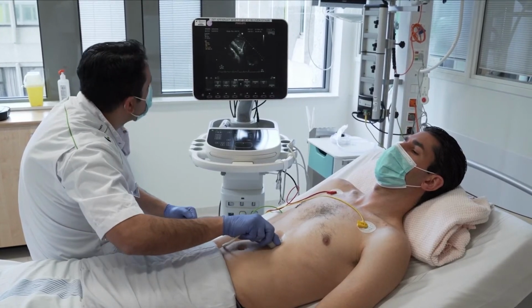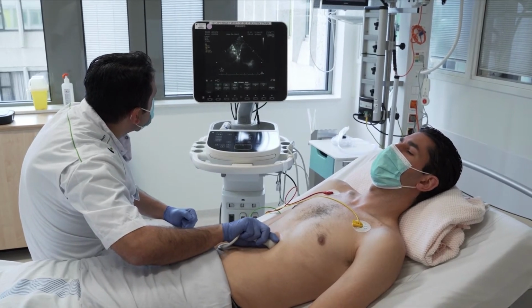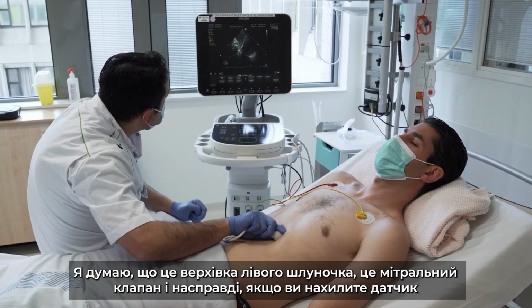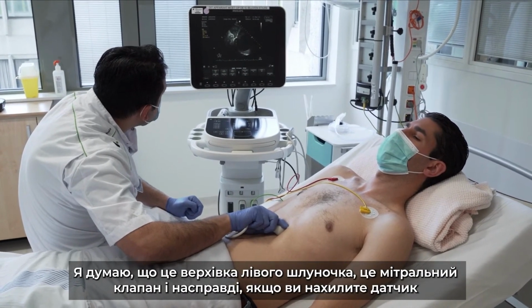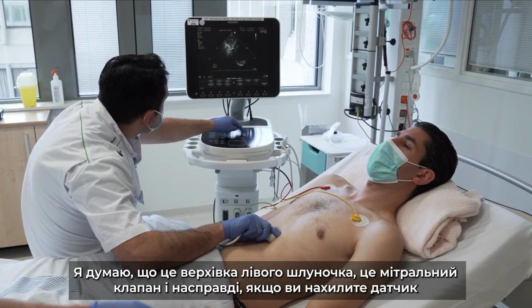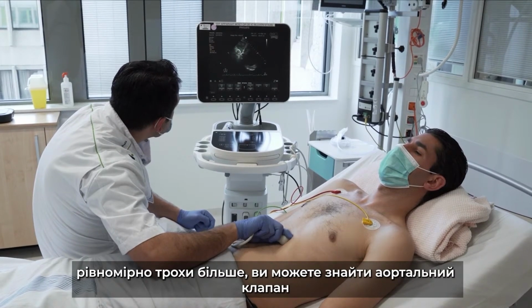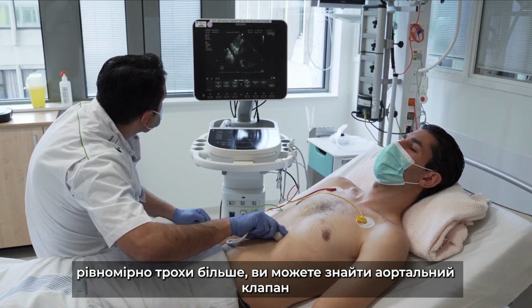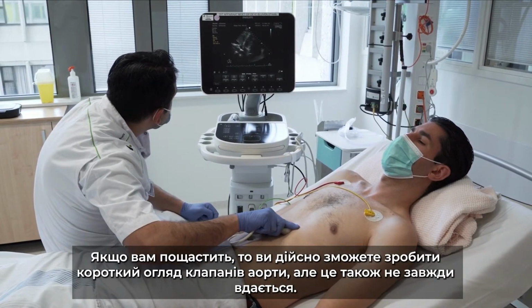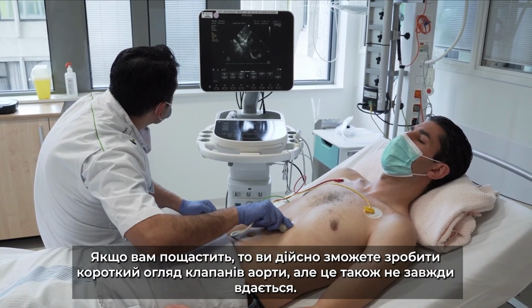Is that the mitral valve? We need some patience. Yeah, we are coming. This is a very nice view of, I think, the apex of the left ventricle. And there is the mitral valve, and actually, if you tilt it even a little bit more, you might find the aorta valve. Other way around, I think, if you're lucky. And then you can actually make a short axis view with the aorta valve if you're lucky.